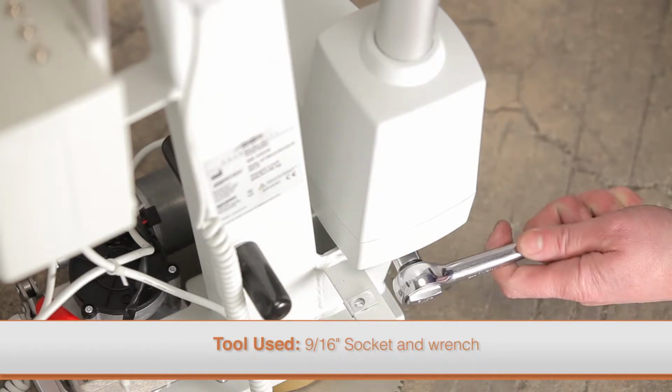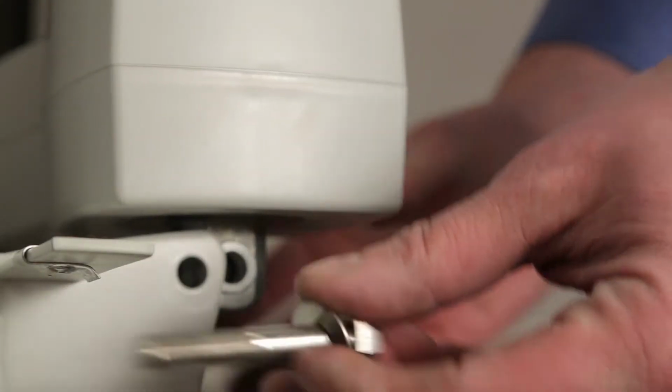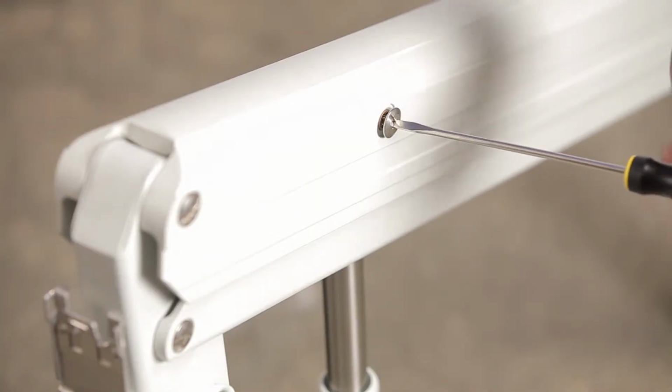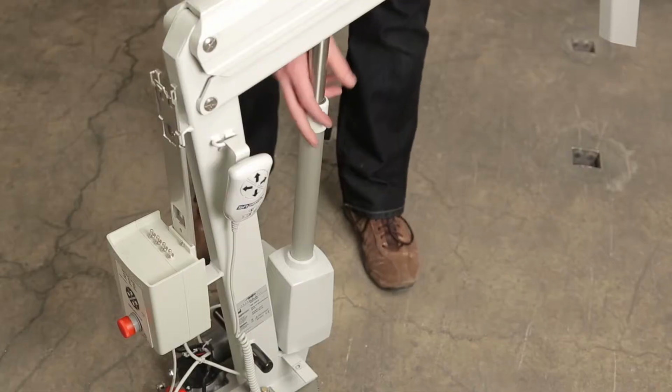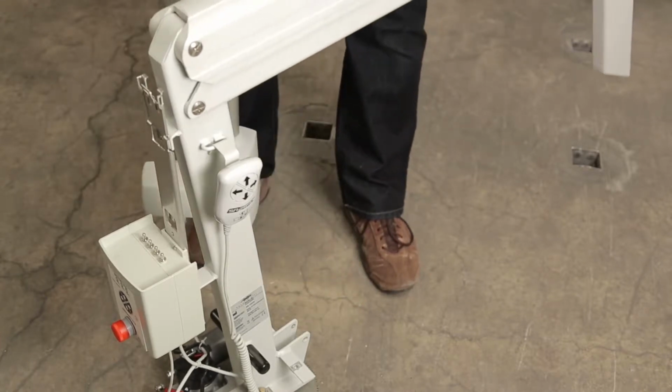Next, loosen the nut at the bottom of the actuator using a socket wrench and remove the bolt. Remove both Phillips screws at the top of the actuator using a small flat blade screwdriver. Remove the two bearing sleeves and the support rod, then remove the actuator. Carefully lower the support arm so that it rests on the ground.